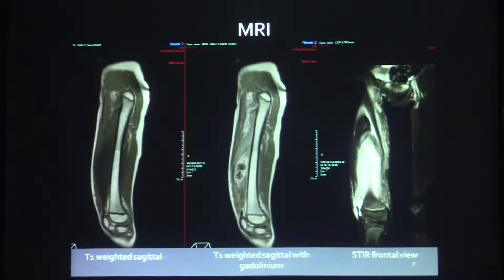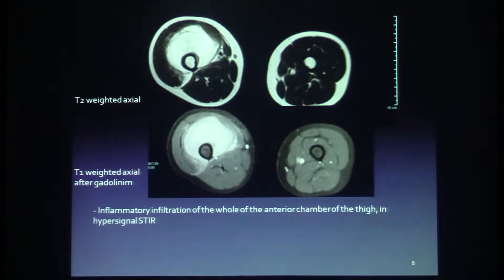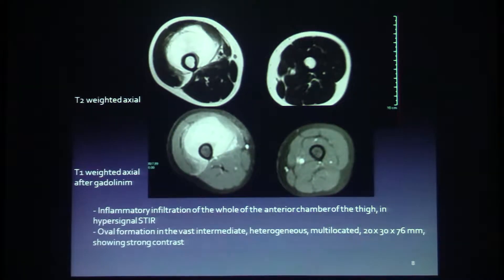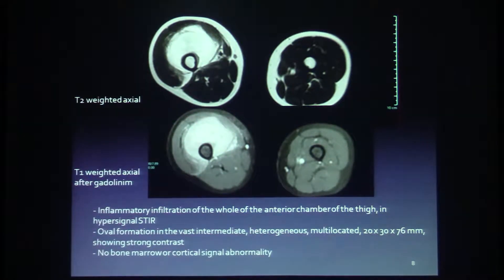So you have sagittal T1, T1 with gadolinium, coronal frontal view, T2 axial and T1 after gadolinium. The MRI shows inflammatory infiltration of the whole of the anterior chamber of the thigh in hyper-signal STIR. Oval formation in the vastus intermedius, heterogeneous, multi-loculated, 20 x 30 x 76 mm, showing strong contrast enhancement. No bone marrow or cortical signal abnormality.